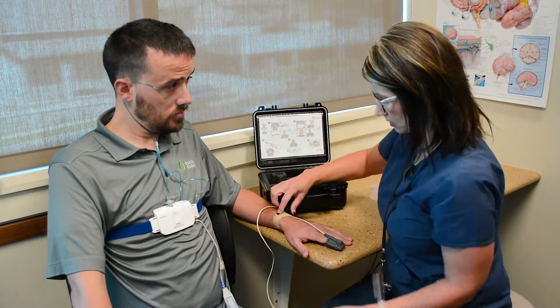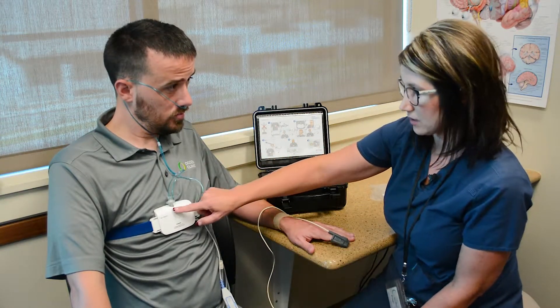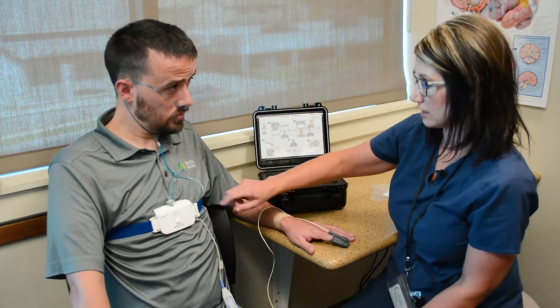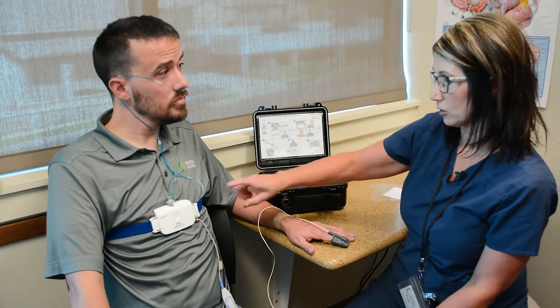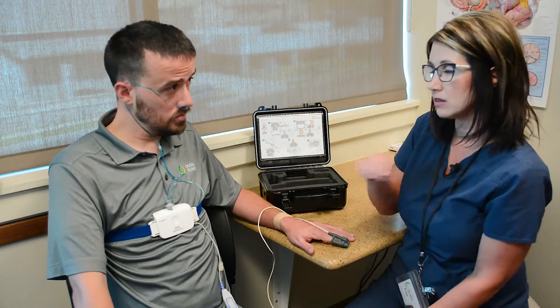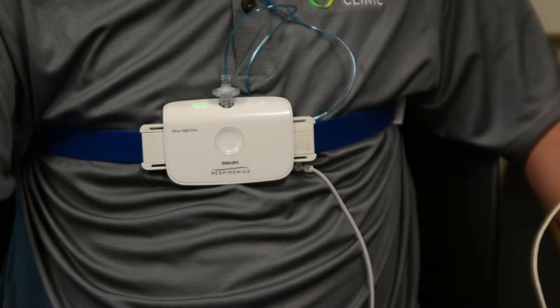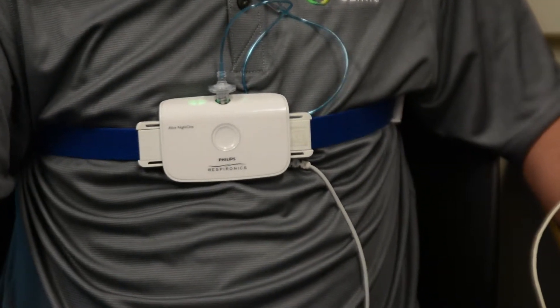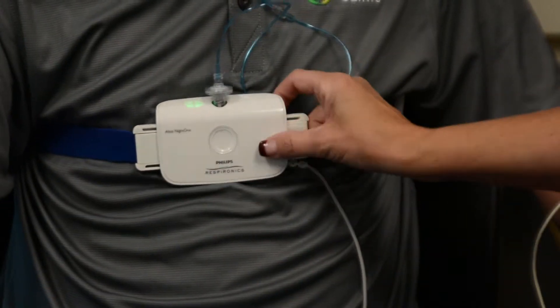Now that it's all on and all the lights are on and reading, these are going to start powering down — you'll start to see each one of these lights power down. The lights do not stay on all night long, so we don't want anybody to panic. The machine hasn't turned off; the lights have just turned off. They'll continue reading throughout the night.